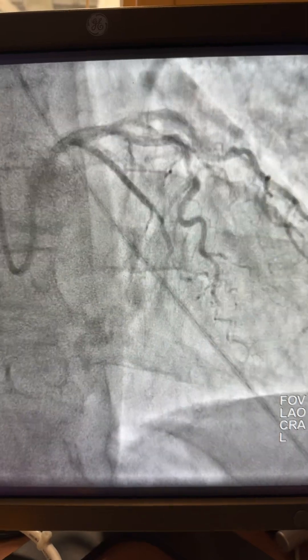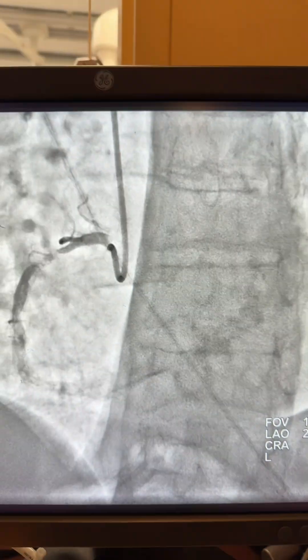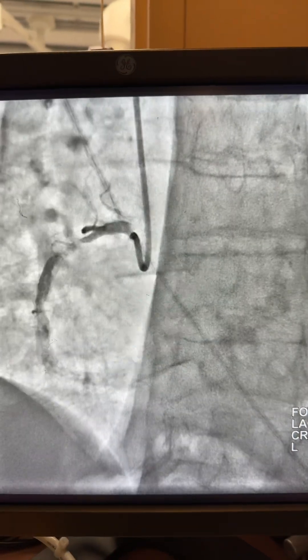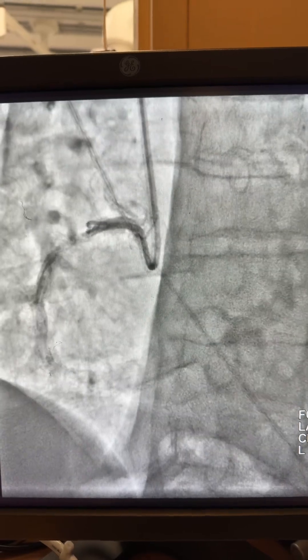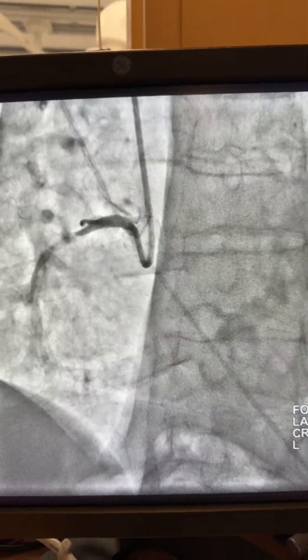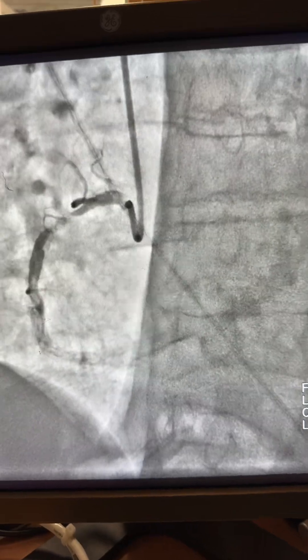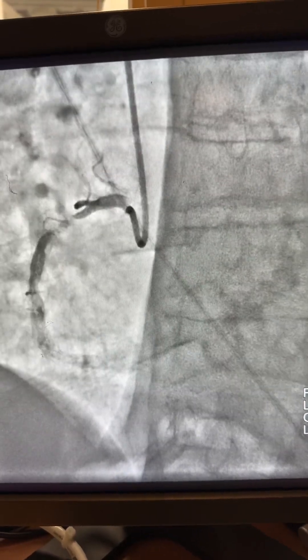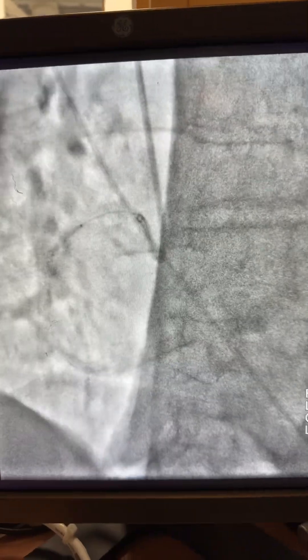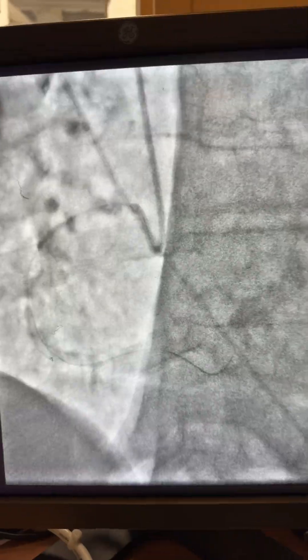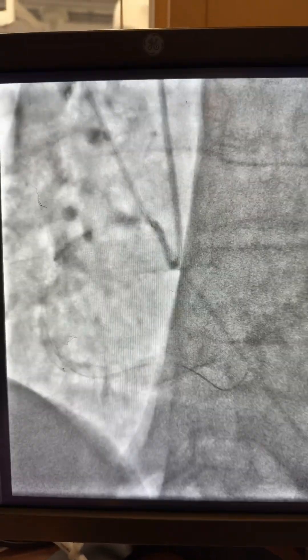The case was started first for the left system using an EL guide, and you see there is a mid-segment lesion in the LAD. By moving toward the RCA, you see the culprit in the proximal and mid RCA. I have the nice support from the guide, which is AL-75.